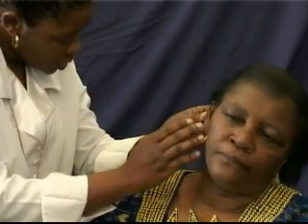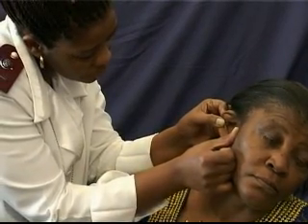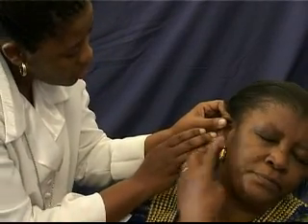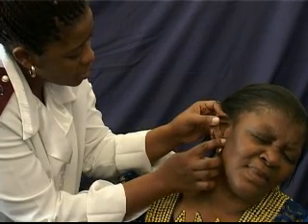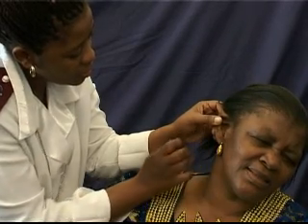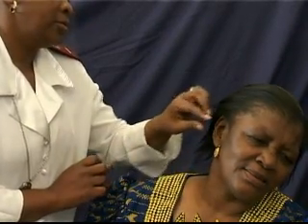Prior to the insertion of the speculum into the ear, carry out a visual examination of the parts of the outer ear to see if there is any discharge of fluid or blood. Also touch the ear to ascertain the sensitivity of the area to pain. If there are excessive amounts of ear wax in the ear canal, these should be removed using a recognized cerumen removing procedure prior to the ear examination with the otoscope.